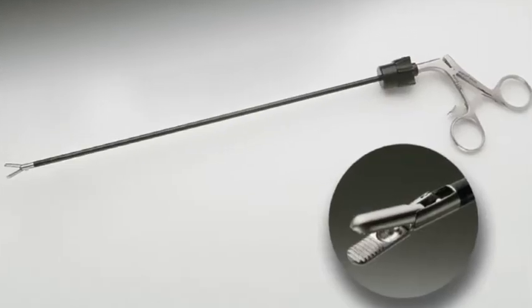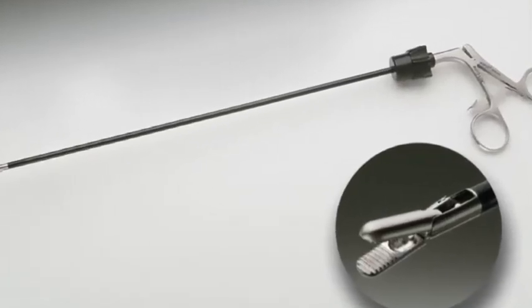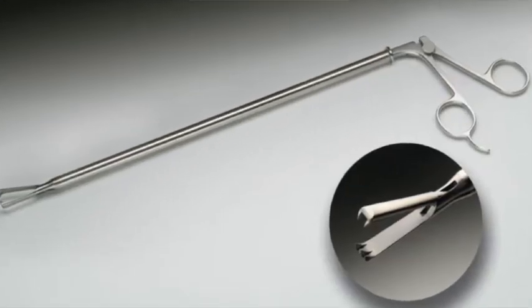We have another blunt grasper — there are a couple of blunt graspers, so just ask the surgeon which one they want. The claw grasper is harder, thicker, and bigger — usually 10 millimeter. Surgeons sometimes call them the 'big jaws of life.' When ready to pull out a specimen that can't fit into the endo catch, they'll grab these to hook onto the organ — gallbladder, appendix — and pull it out. Those are your claw graspers, used for grasping and holding.